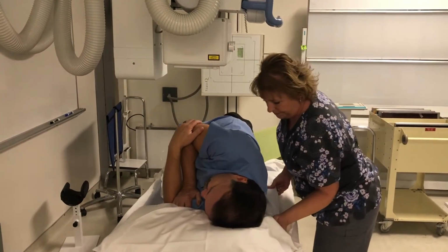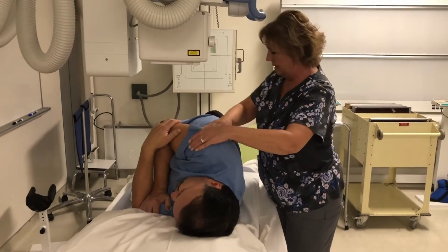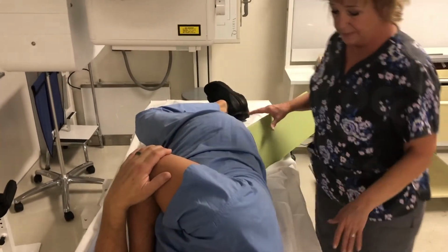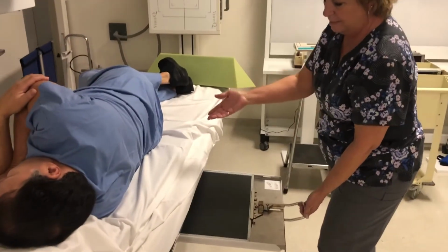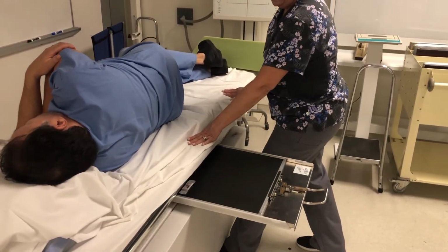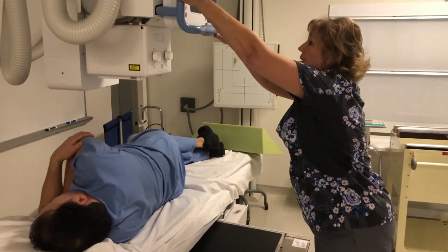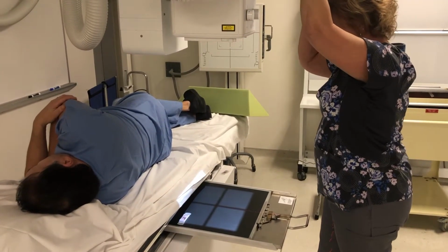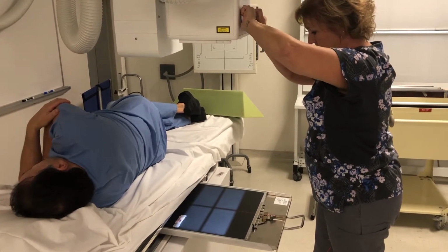So I want to make sure that my shoulders and hips are in the same plane. Flexing the knees helps them balance. I would swap out my 14 by 17 for another 14 by 17. I'm going to go back down to the 7 by 17 collimation.